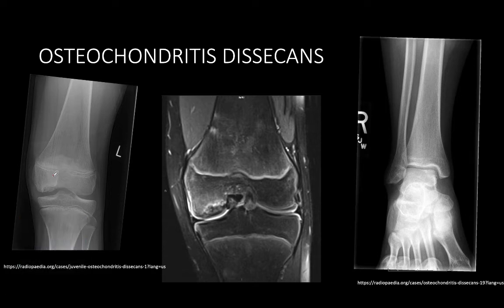And so you'll notice this osseous defect along the femoral condyles that's kind of semicircular in configuration. And this particular fragment is still in situ. That means it's still in its original location. It hasn't broken off to float around. But in the case that it did, we'd call it a loose body. So osteochondritis dissecans is very commonly leading to loose bodies in the joint when the fragment migrates away from its original location. At that point, we'd call it an osteochondral defect on the femur and be looking for the osteochondral fragment from which it came from the condyle.